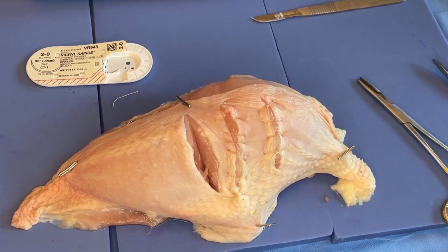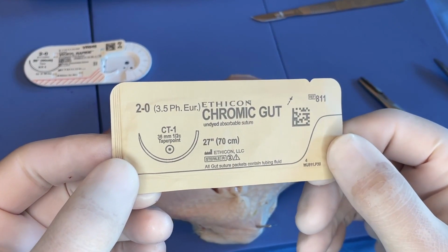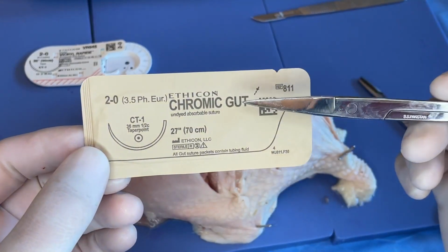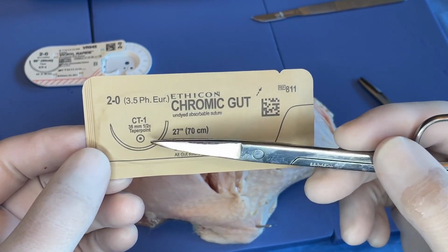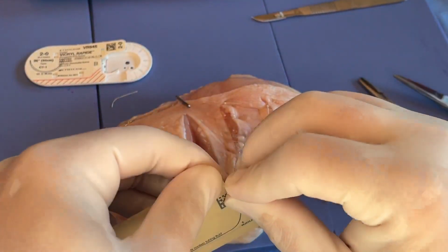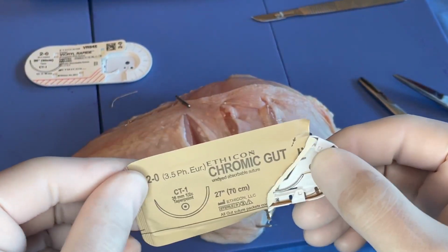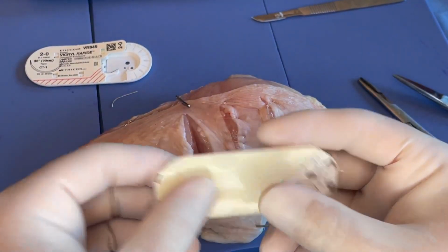All right, so we're going to be looking at a running locking suture. We've got a different suture here. Instead of that 2-0 that I had, now I've got a 2-0 chromic. So again, 2-0 chromic gut. This is on a CT1 needle. Again, it's a half needle, the tapered point. We've got a 70 centimeter length to it. As opposed to Vicryl coming dry, chromic and gut usually come in alcohol to keep them moist, because when they dry out, they get quite brittle.